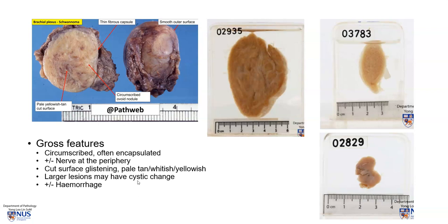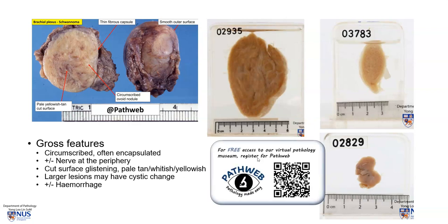Larger lesions may have cystic change as well as hemorrhage. All these are examples of fully interactive virtual pathology specimens, and these are taken from our free online resource, PathWeb. You can scan here for free registration, or the link is also in the video description.